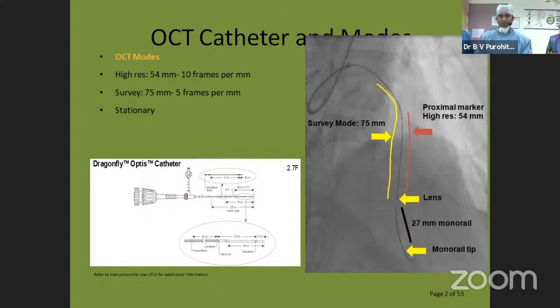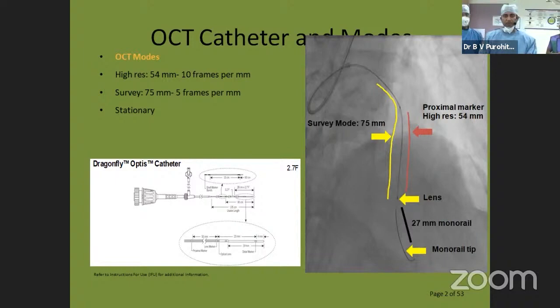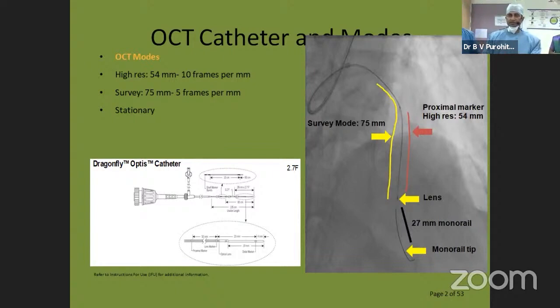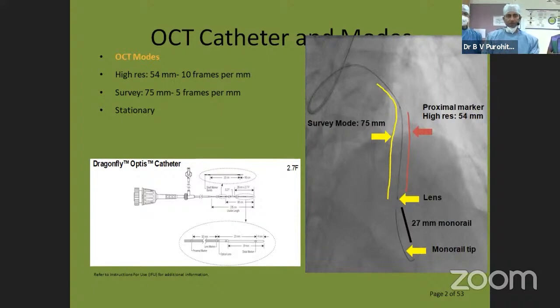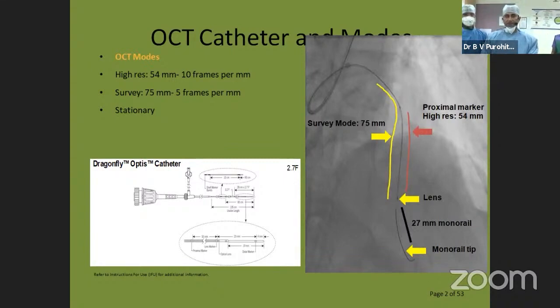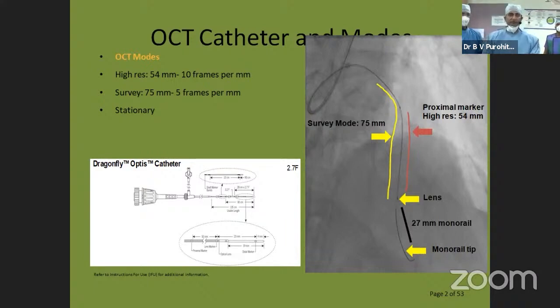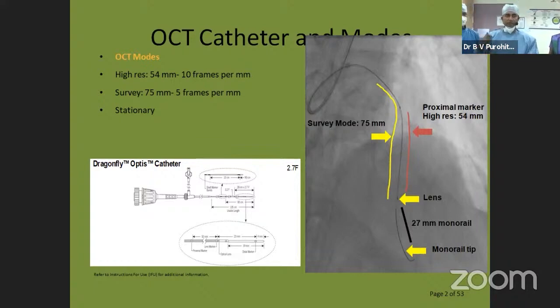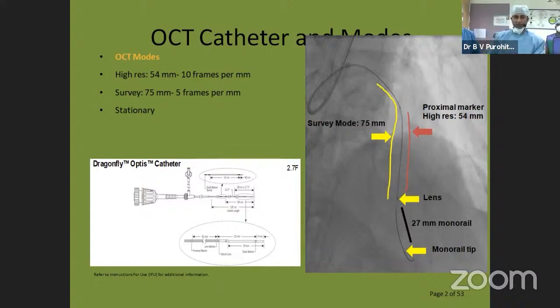This catheter has three markers. The distal tip, then almost 27 mm before it is the lens marker — when taking an image, the lens marker should be crossing the area of interest. Then you have a proximal marker, almost 54 mm before that. This 54 mm is the high-resolution zone. For the initial run, we take a fast frame in survey mode at 75 mm. At the proximal part of the catheter is a hub through which you flush and clear the contrast from the system.